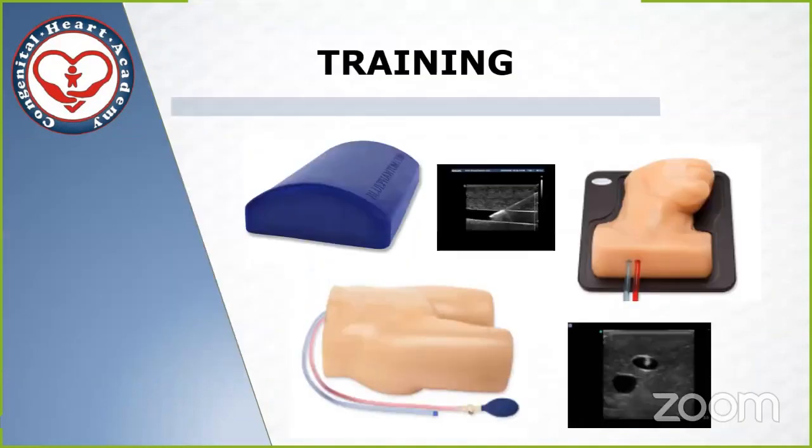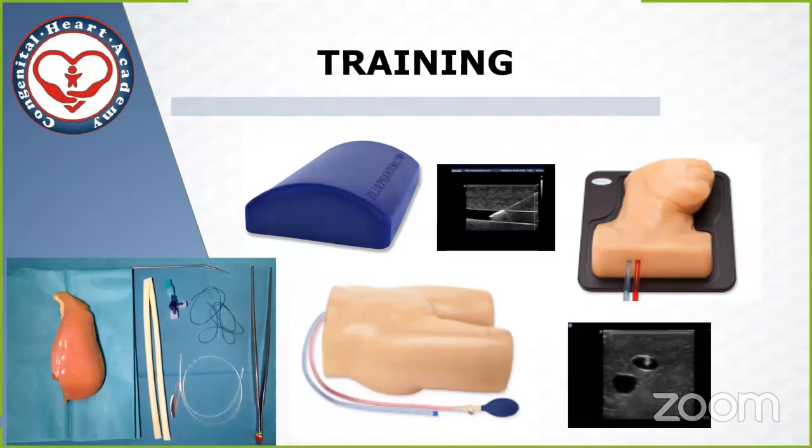Last but not least is training, right? There is a lot of opportunities to train. We want to avoid the training on our patients, but the problem with the mannequins is that they are expensive. We have used some other homemade phantoms that have given us a lot of important information, and we have used them to train our fellows with good results.